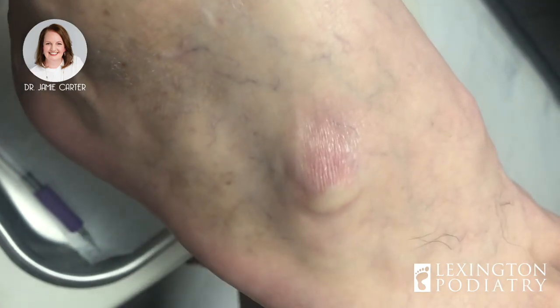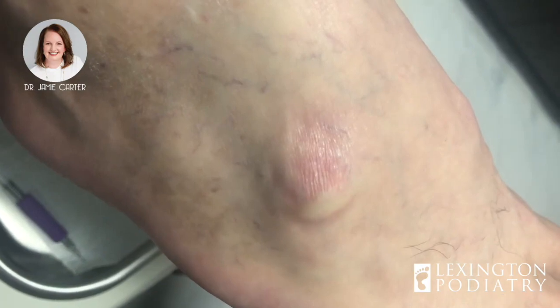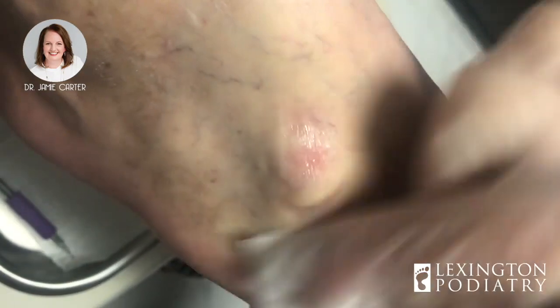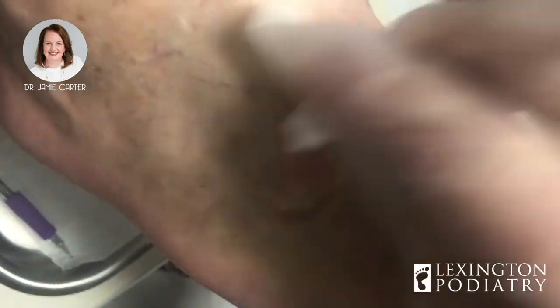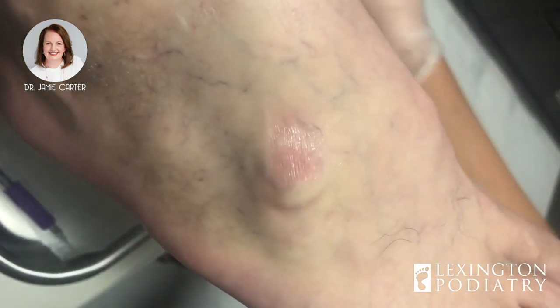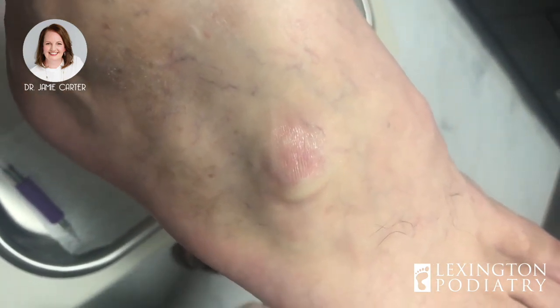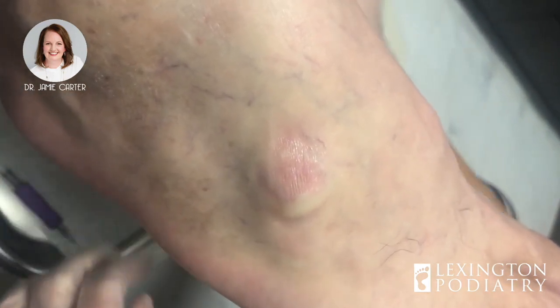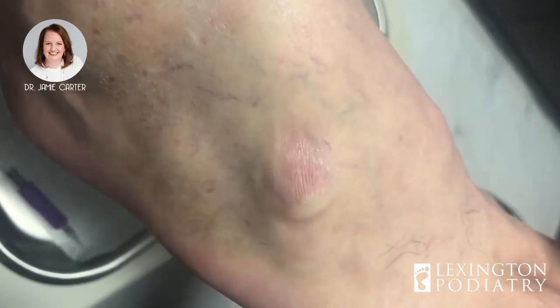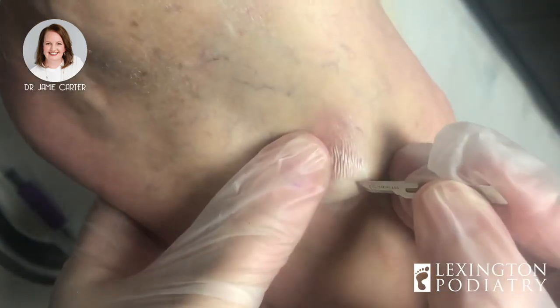Today this gentleman comes in and he has a ganglion cyst, which he's had before — it reoccurred after about nine months after having it aspirated the first time and injected with steroid. So we're going to do the same thing again today. Some people will numb these up, but I don't like to put patients through that extra torture, so I like to use the cold spray and spray it on his foot and then just puncture through the skin really quickly.